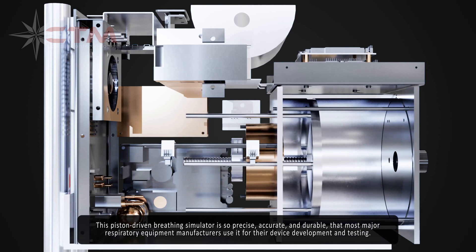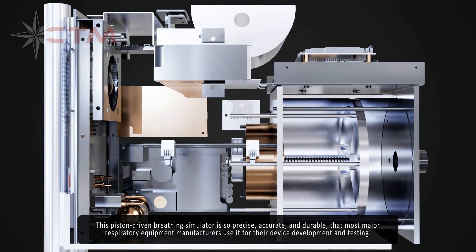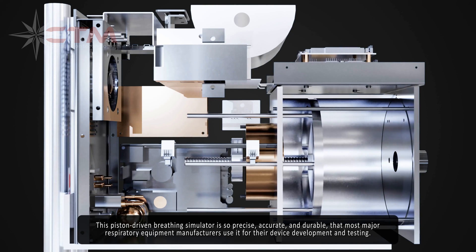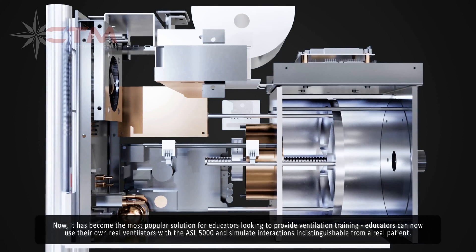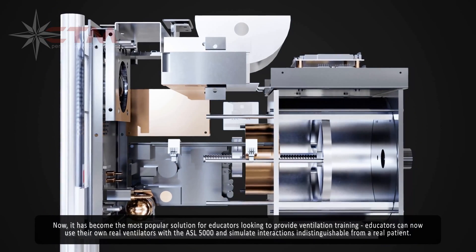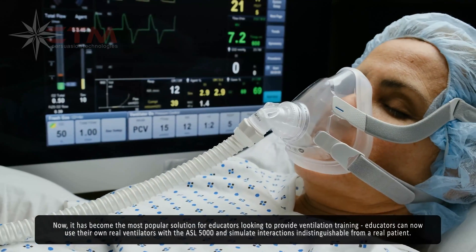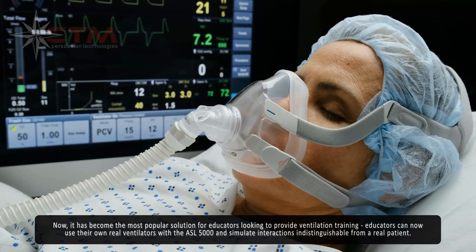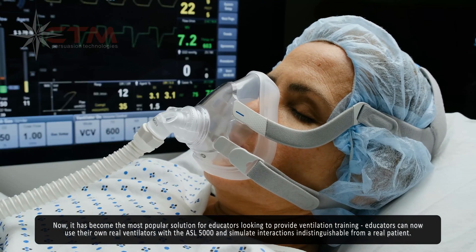This piston-driven breathing simulator is so precise, accurate, and durable that most major respiratory equipment manufacturers use it for their device development and testing. It has also become the most popular solution for educators looking to provide ventilation training. Educators can now use their own real ventilators with the ASL5000 and simulate interactions indistinguishable from a real patient.